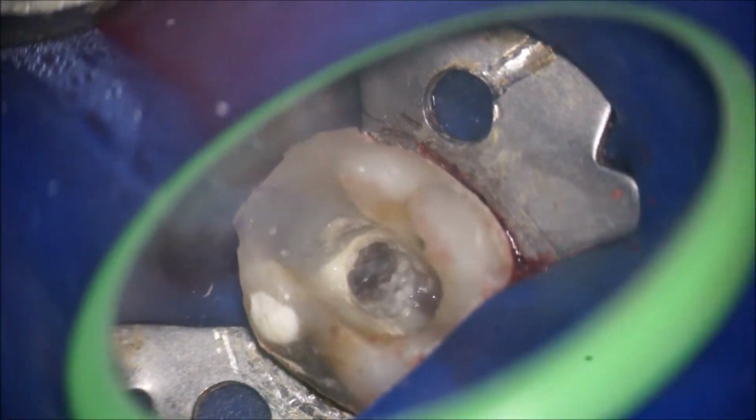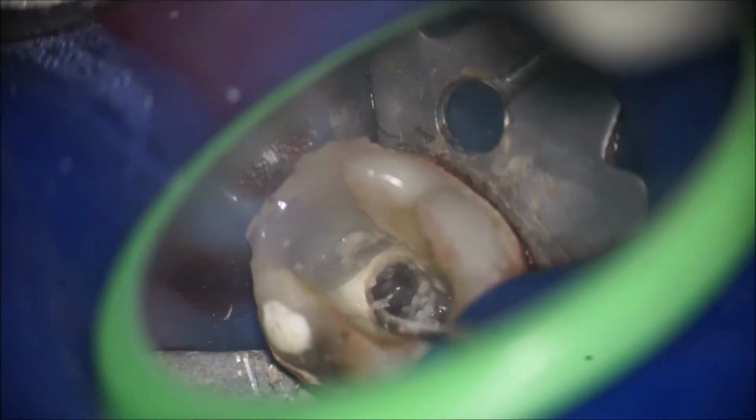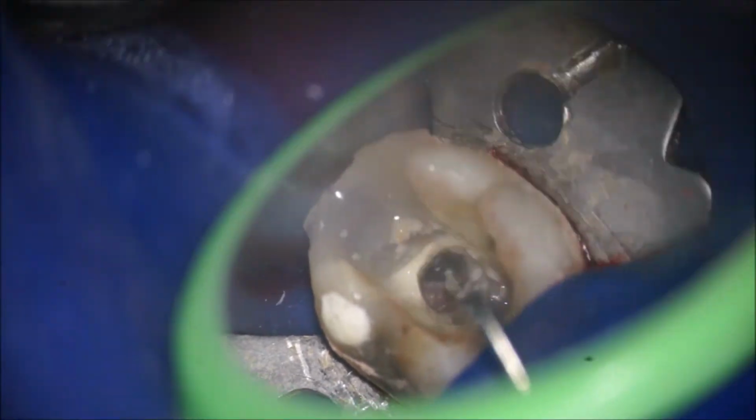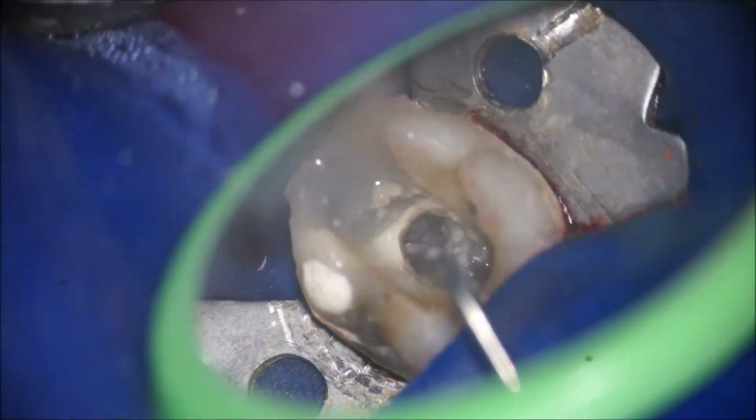It was very firmly attached to the site with small, almost like tissue tags. It's like multiple little fingers that have grown into the dentin surface, and scraping it off seemed to be impossible. I don't often do it, but I think it's justified in this case.